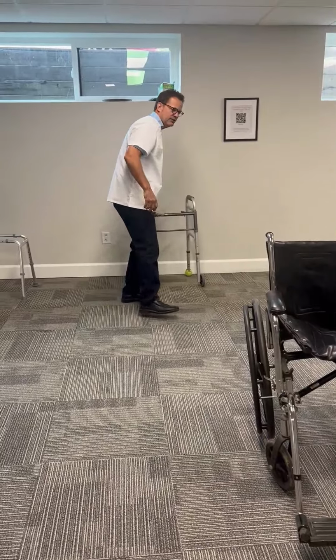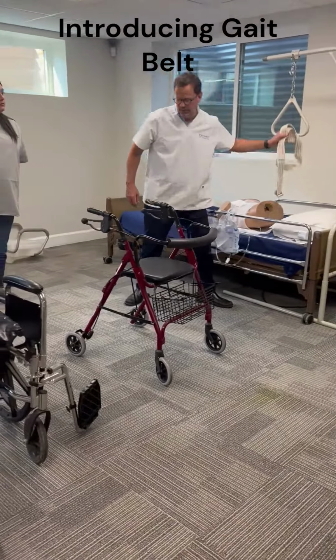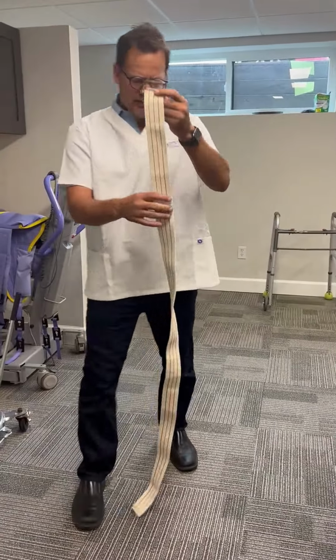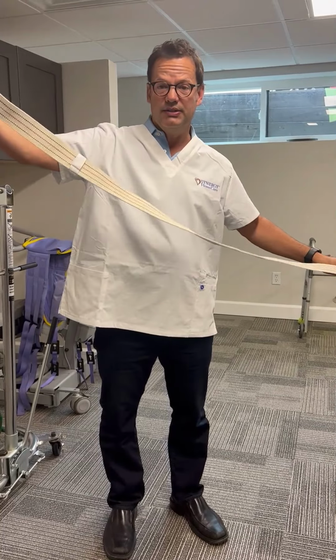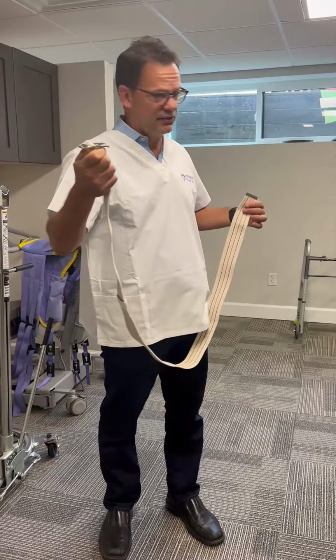I want to now get into transfers. The first thing that is important is for anybody that we are assisting, we always, there's three always, use a gait belt. Absent a gait belt, you cannot do a transfer safely.